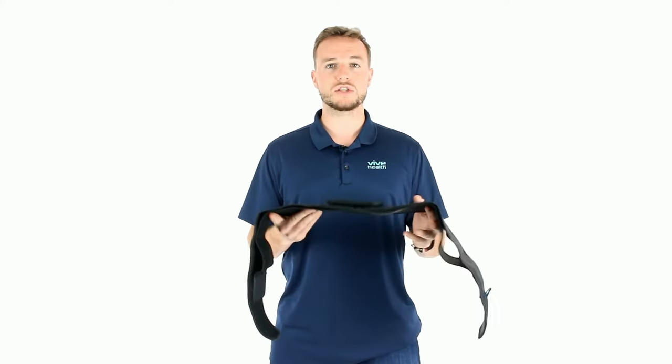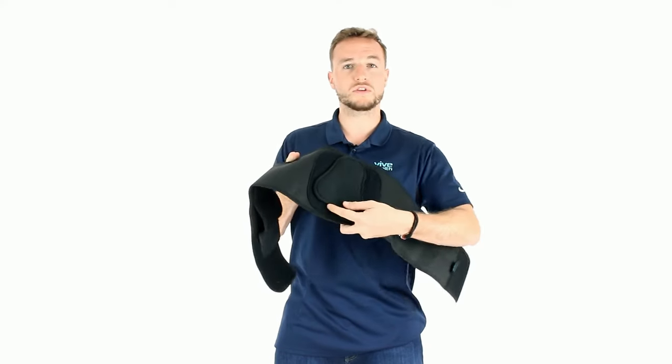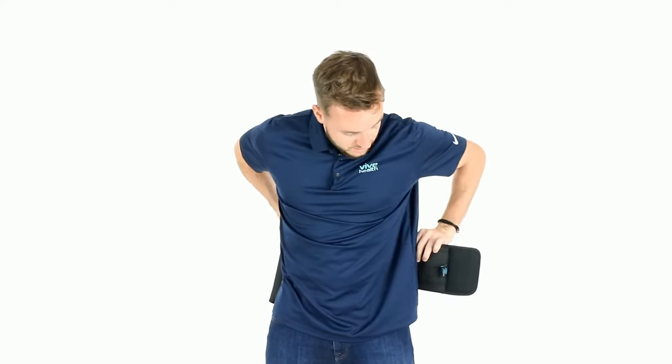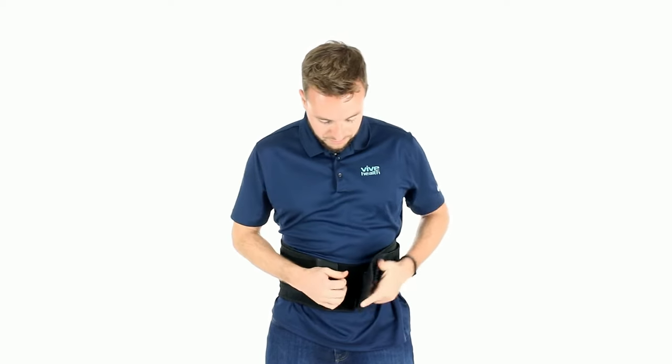Let's go over how to actually put the brace on — super simple. You want to put the larger part of the triangle of the removable panel on the bottom, or the base part of your back. You're going to slide that to the middle of your back and then take the two panels here in the front.